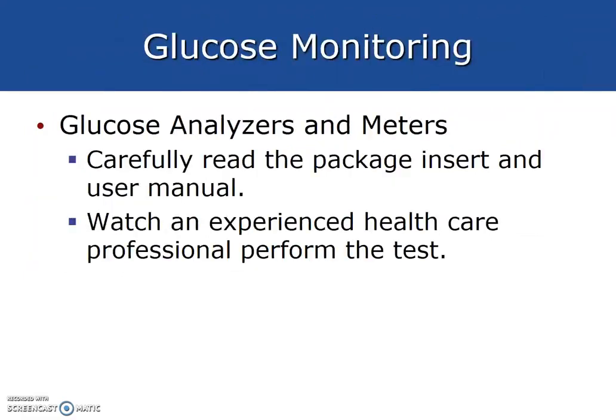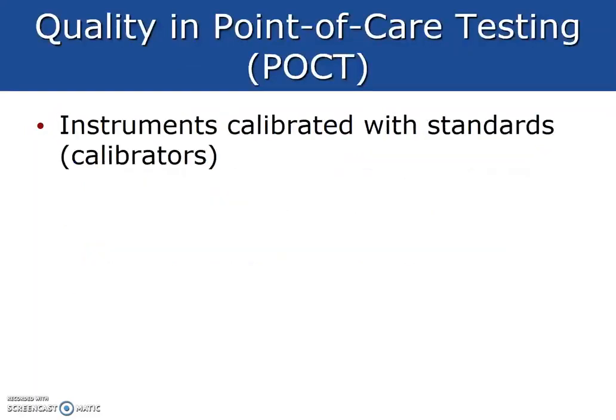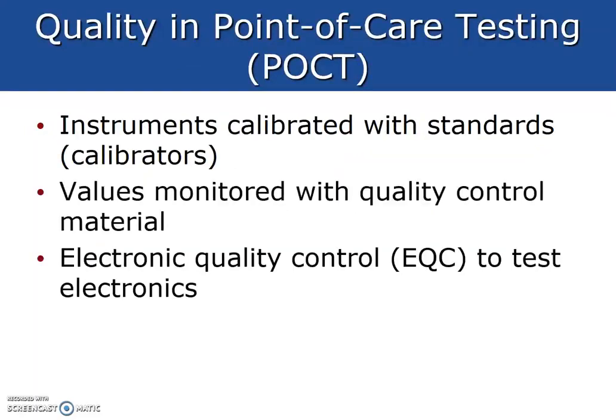Glucose analyzers, carefully read the package insert and user manuals, as every machine operates slightly differently. Strictly follow daily quality control procedures. This is really essential because if the machine is reporting out abnormally high or low glucose levels, we could misdiagnose our patients. I'm going to have you review this slide on your own.